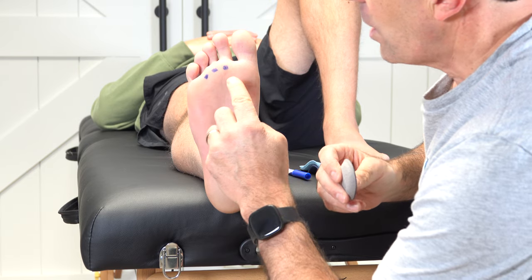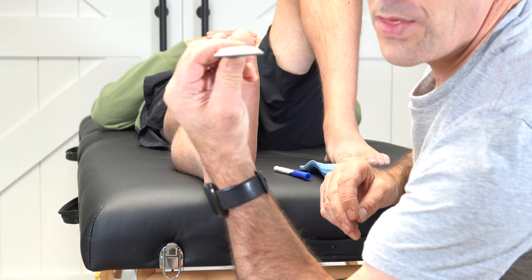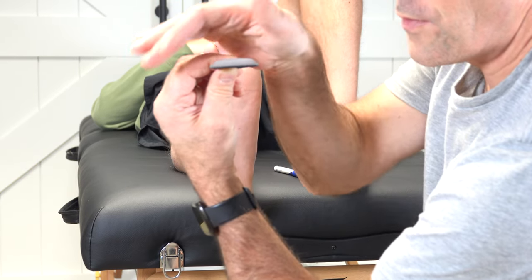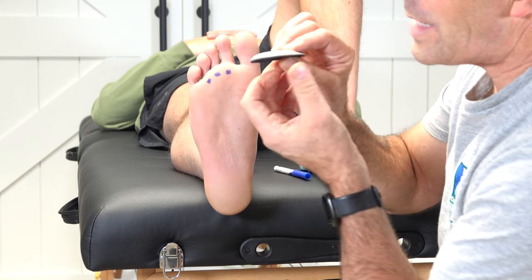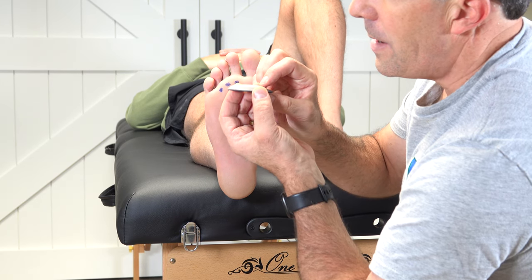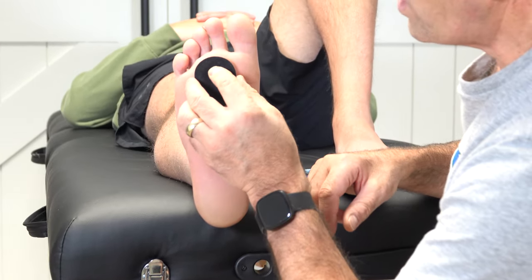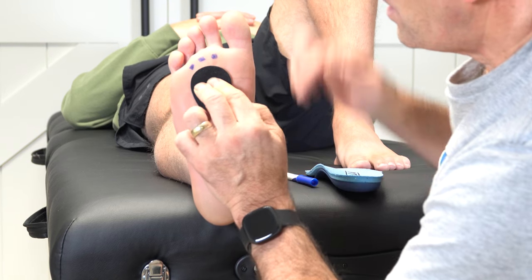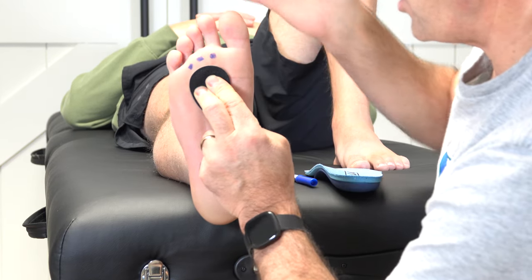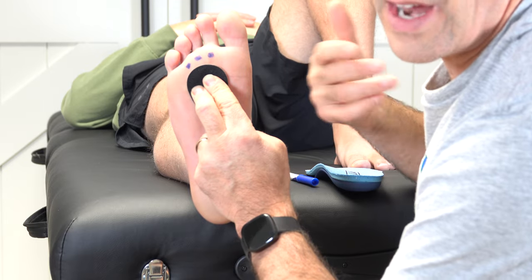Most people who have metatarsalgia lose this arch in this part of the foot. The metatarsal pad, as you can see here, is a little bit thicker in the middle and tapers off to both sides, so that's going to help reestablish this arch in the foot. We also want the metatarsal heads to fall off the cliff of the metatarsal pad — we don't want to put this on the sore spot, because they're already having a lot of inflammation there. We want to put this metatarsal pad just behind the sore joints, so when they put weight on it, it's going to help reestablish the arch and allow those joints to fall off the cliff and not get irritated with every step.